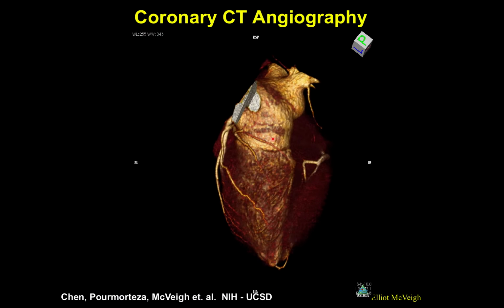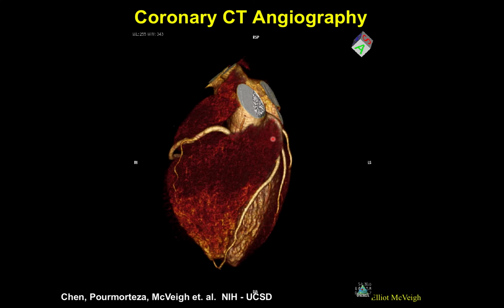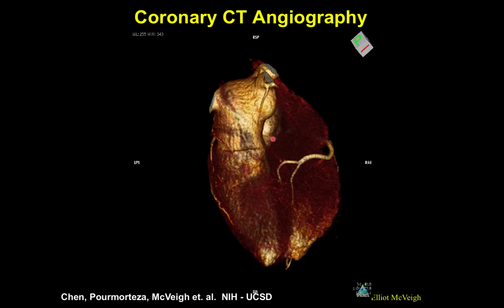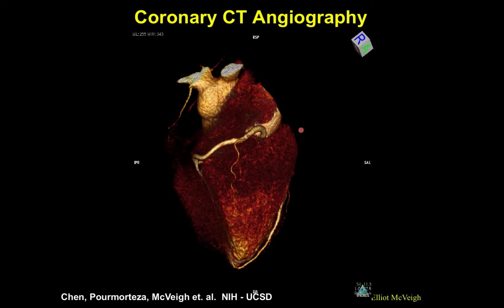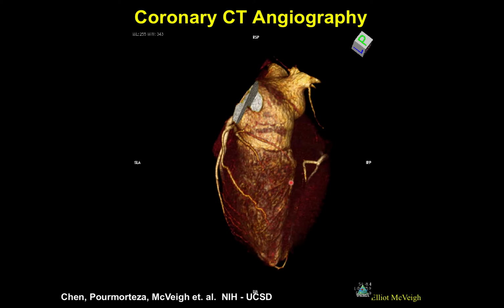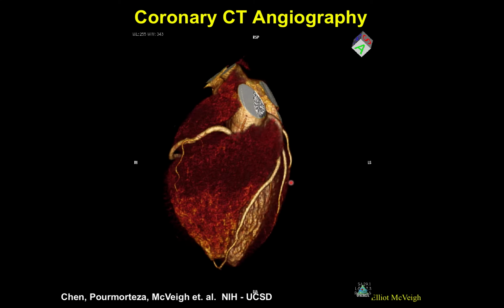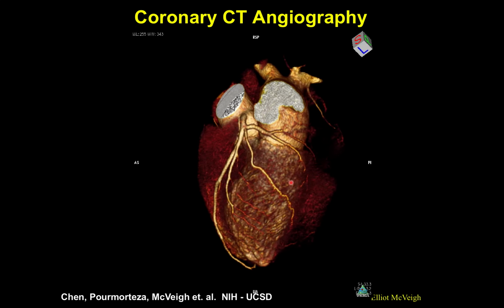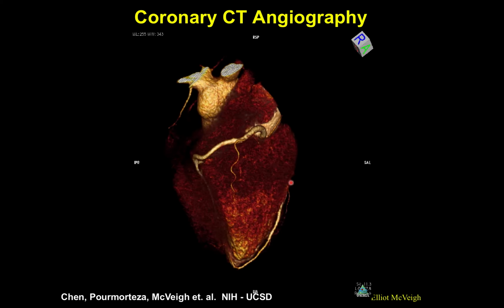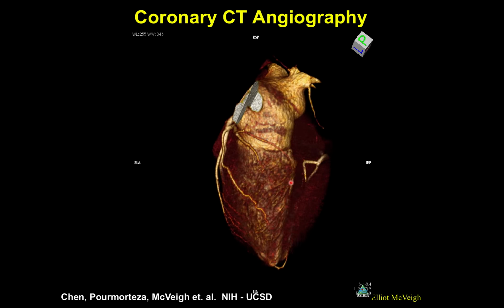Here's an example of rendering that volume data as essentially an opaque object with a lighting model, and then the vessels show up as these opaque objects here. This type of data is not commonly used for diagnosis, but it is used to determine whether or not the images look reasonably good. When this data looks good, you know your images are probably artifact-free, and so clinicians then use the raw images themselves in stacks to make the diagnosis.